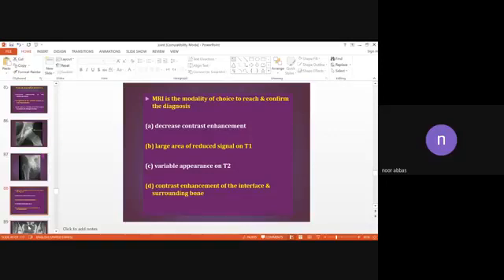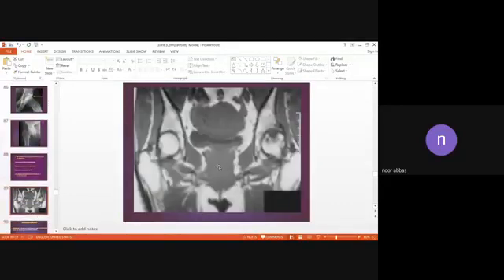Avascular necrosis can be diagnosed radiologically, but MRI is the modality of choice for early diagnosis of the condition. It will show the early marrow abnormality within the femoral head, seen as an area of loss of the normal marrow pattern in the femoral head and the formation of subchondral lines that are seen in patients with avascular necrosis.